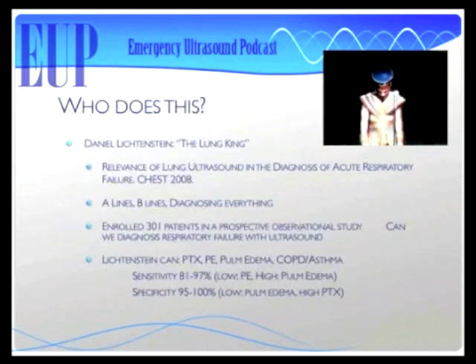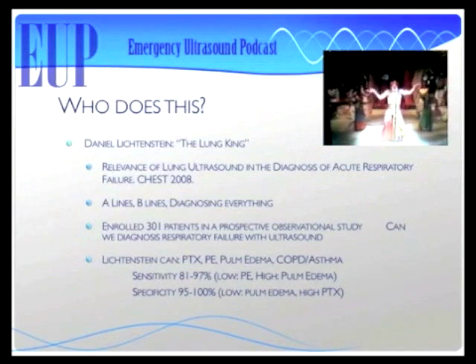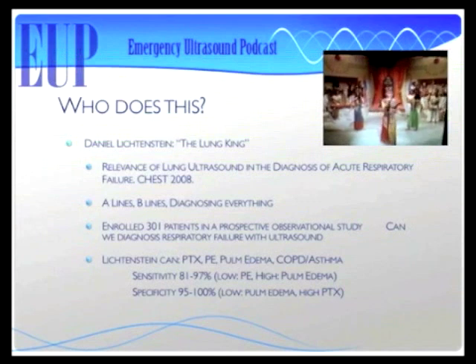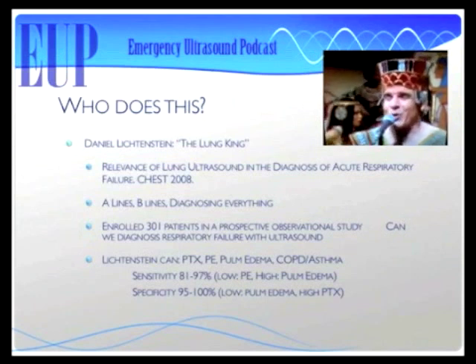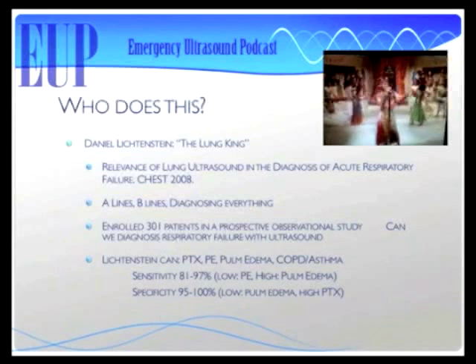So who does this right now? Who actually uses ultrasound in the evaluation of dyspnea? There's this guy, I think he's somewhere in Europe. He's one of those European fellows, Daniel Lichtenstein. And Dan, I'd like to think of as sort of the lung king. And he's done a lot of publications in this journal called Chest. Have you ever heard of? More of a pharaoh than a king you're showing there? That might be a good point.